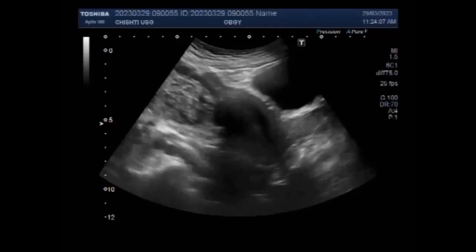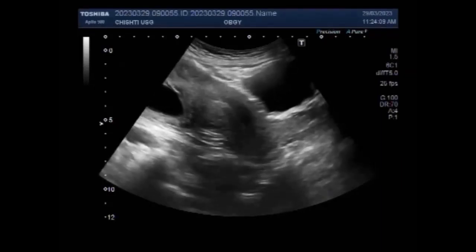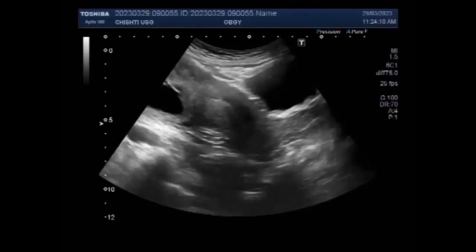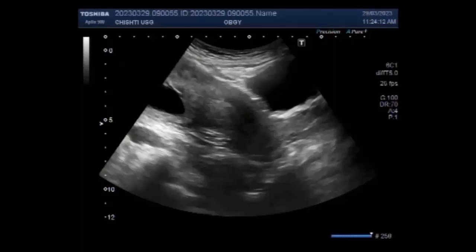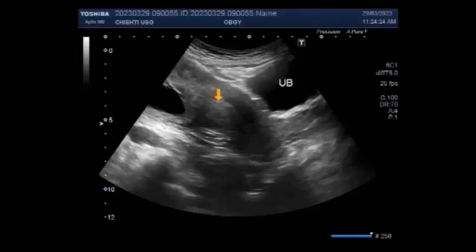Hydatidiform mole is a common complication of pregnancy. It is also called molar pregnancy. It consists of a non-viable embryo which implants and proliferates within the uterus. But in this case, the viable alive fetus is seen. The duration of pregnancy is about 21 weeks and partial hydatidiform mole is also seen.